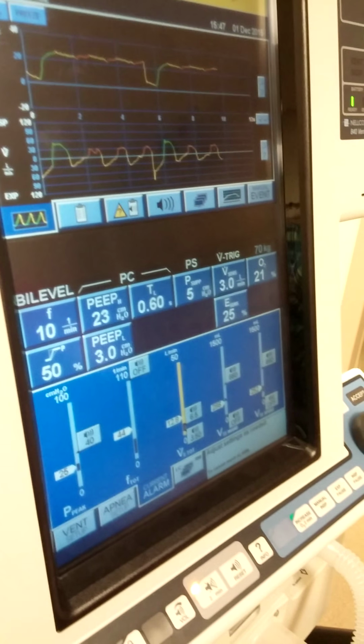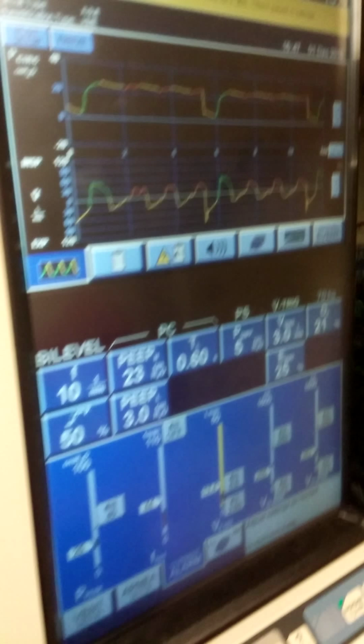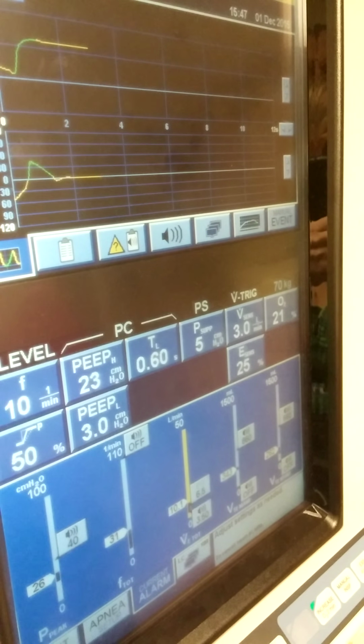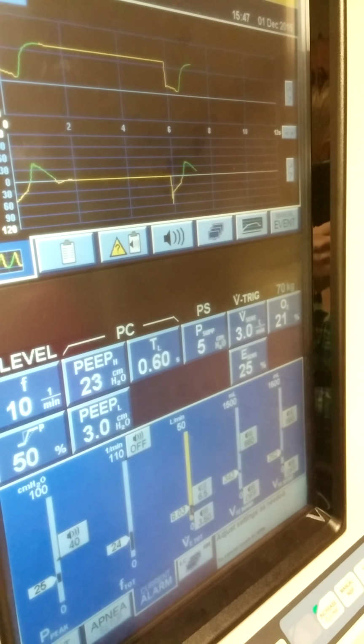Okay. For peep high, a number 10 to 30. Where do we set peep high? 10 to 30. Well, if you look at it, you're going to be given a plateau pressure. So whatever the plateau is, you want 80 to 100% of that plateau.